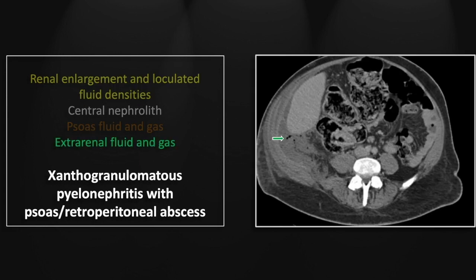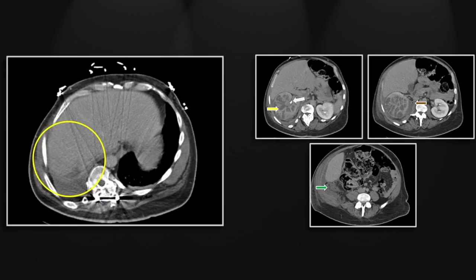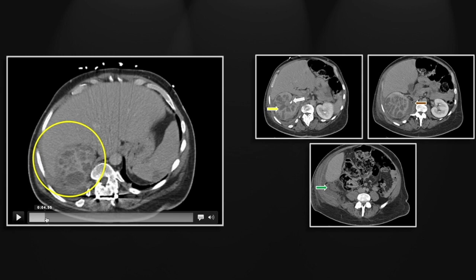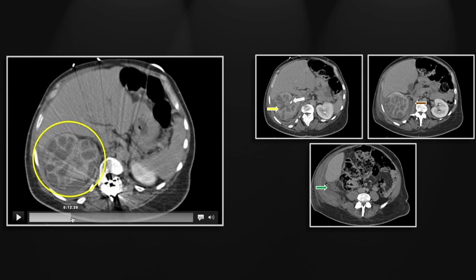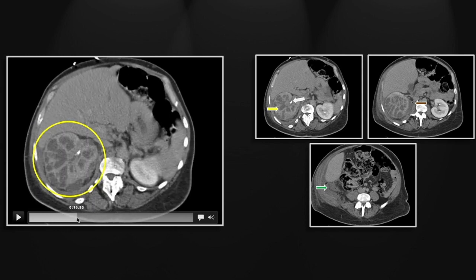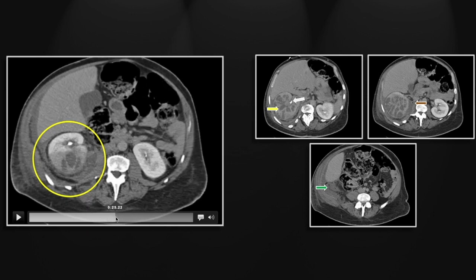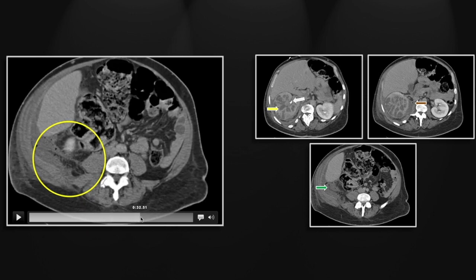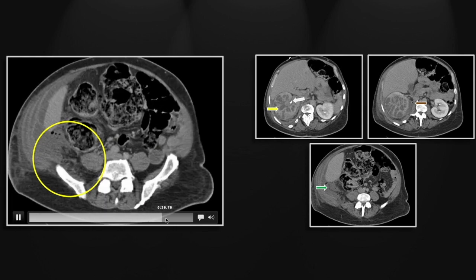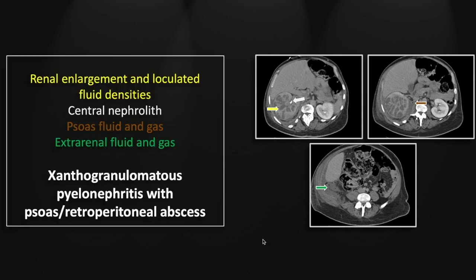Speaking of extra-renal involvement, there is more extra-renal gas and fluid in the retroperitoneum. On the cine, that marked enlargement of the right kidney, the central stone, and the extra-renal extension both medially and inferiorly. So that is a case of xanthogranulomatous pyelonephritis.